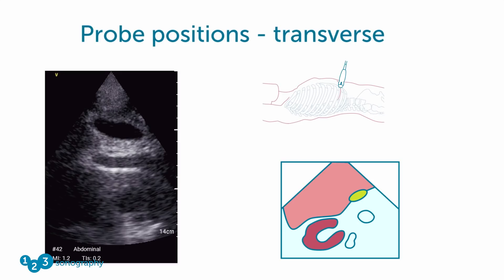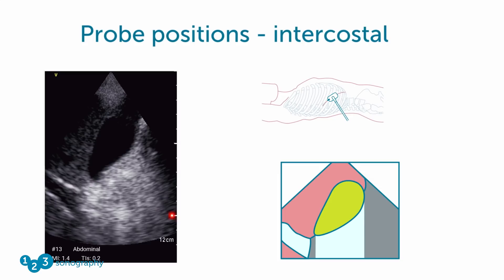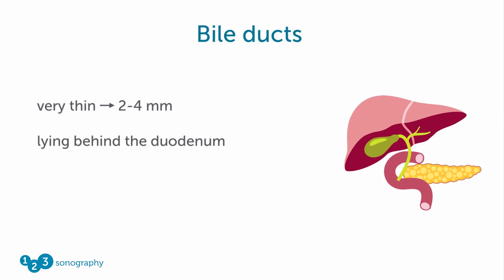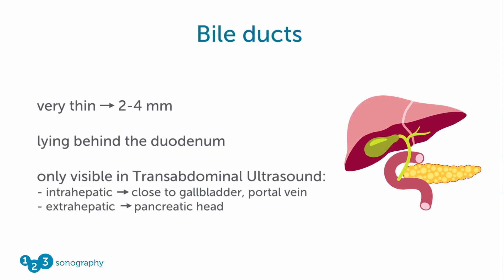Turning the probe counterclockwise 90 degrees gives you a transverse image of the gallbladder. Most patients are not able to inhale maximally, so the intercostal view gives you a nice view onto the gallbladder, the portal vein, and the adjacent bile duct lying close to the portal vein. The bile ducts are normally very thin, having a diameter of 2 to 4 millimeters, lying partially behind the duodenum. You can only see them in transabdominal ultrasound in the intrahepatic part lying close to the gallbladder and portal vein, and sometimes in the extrahepatic part in the pancreatic head.